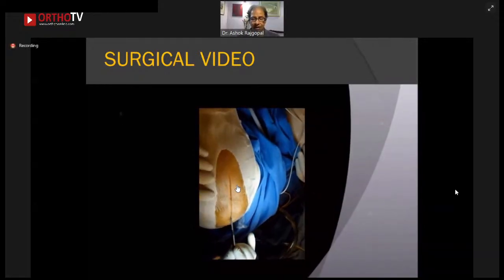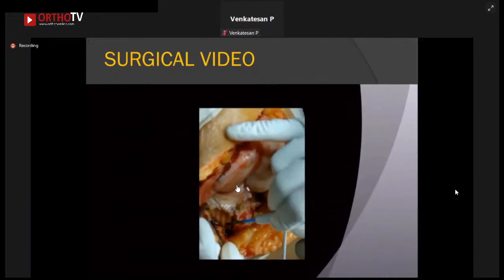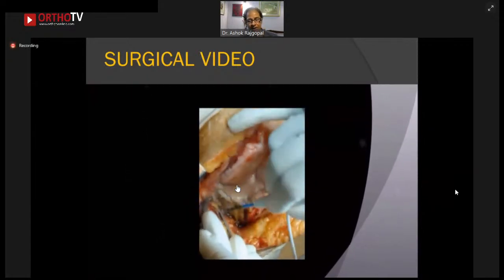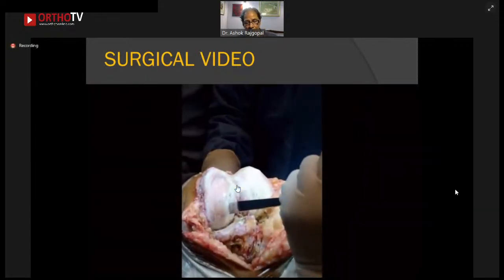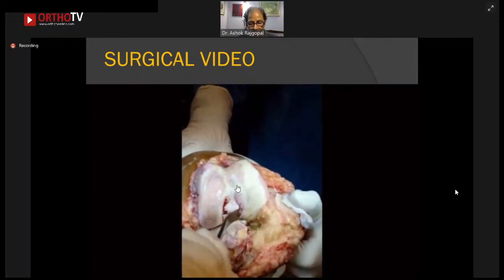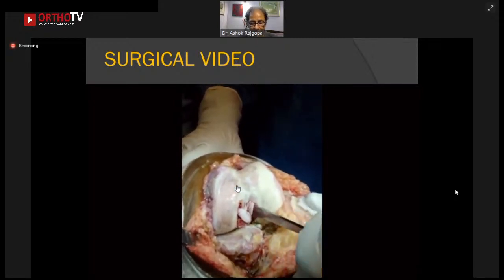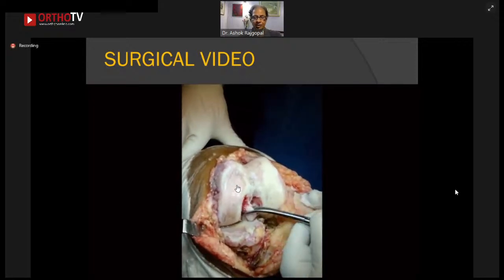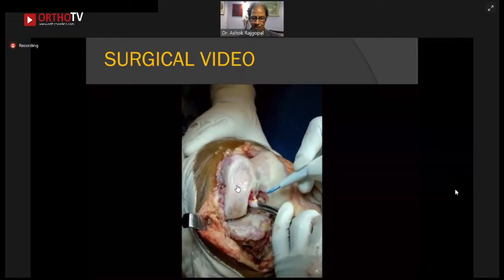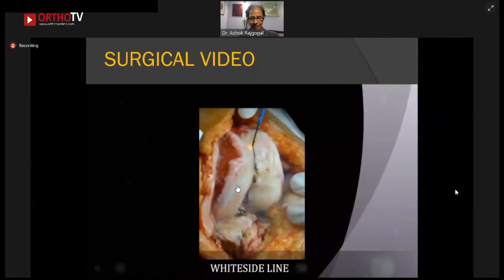We use a vertical midline incision, as I'm sure most of you do, medial parapatellar skin incision. This is what I was saying. We do our releases as part of the exposure. We take down the intercondylar osteophytes because that decompresses your PCL. So we spend a little bit of time trying to open up that intercondylar space, much like the arthroscopy surgeons do a notch plasty. This is an osteotomy plasty, if you like.